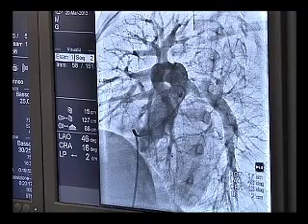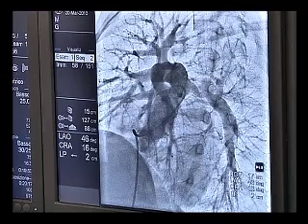We had chosen the Cook Formula stent that has the peculiarity to be able to enlarge to the double of the size at which we implant the stent. So we decided to put a 9 millimeter diameter stent, length 20 millimeter, just to cover the origin of the left pulmonary artery up to the hilum of the same pulmonary artery.